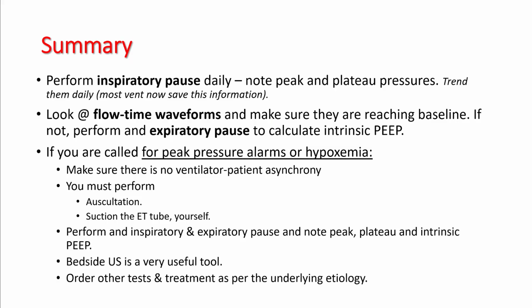In summary, make sure that you perform inspiratory pause daily and note peak and plateau pressures. Most of the vents now save this information, so learn how to get that information from the ventilator. Look at the flow time waveforms and make sure that the expiratory flows are reaching baseline. If not, perform an expiratory pause and calculate intrinsic PEEP.